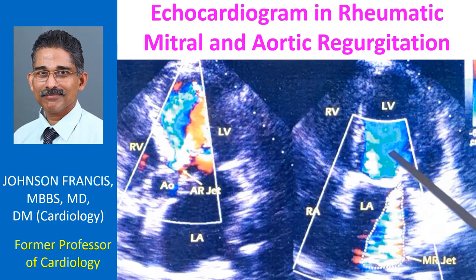In systole, the aorta is not seen here because this is only a 4-chamber view. This could be the flow towards the aorta. Here, there is also a blue flow, but that cannot be flow towards the aorta as it is diastole.